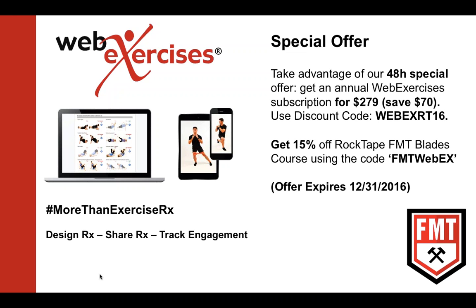I've tooled people with acute ankle sprains. I've tooled people with acute shoulder sprains. And I didn't go killer into the tissue. I just feathered them to downregulate their pain. I taped them, and then I took them through some active range of motion and what they could do to tolerance, because our goal, our end result, is to get them to move better that day, not to just throw ice on them, heat on them, stim on them, and send them on their way. I want them to actually improve movement, which gives exercise to the brain, and that's what the brain needs.